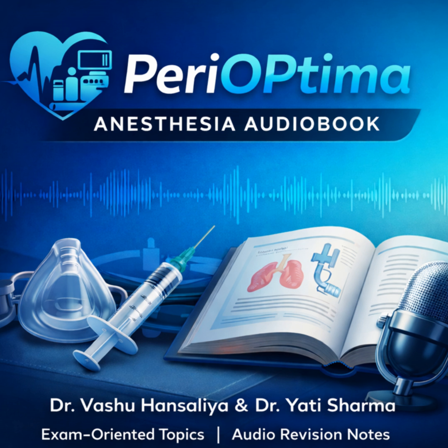We have to start with the classic workhorse, volume-controlled ventilation, or VCV. Right. With VCV, the principle is simple. What you set is what you get. You, the clinician, set a specific tidal volume, let's say 480 milliliters. You set a respiratory rate, say 15. You set an inspiratory flow rate. And the machine just delivers that. It delivers that exact volume no matter what. The flow pattern is usually constant, which looks like a square wave on the ventilator screen. That's a key feature to mention.